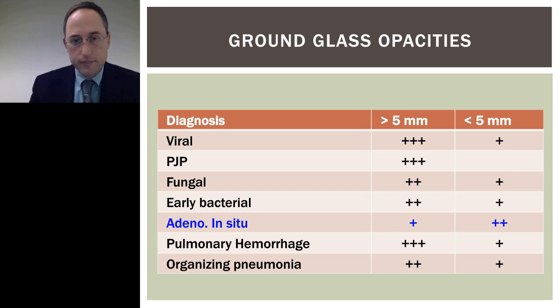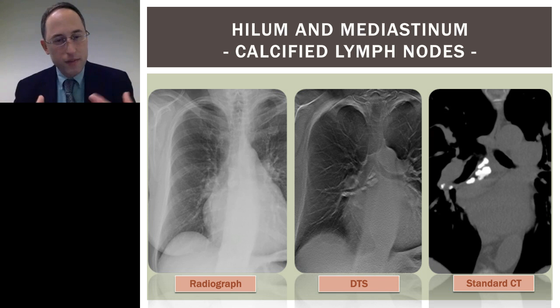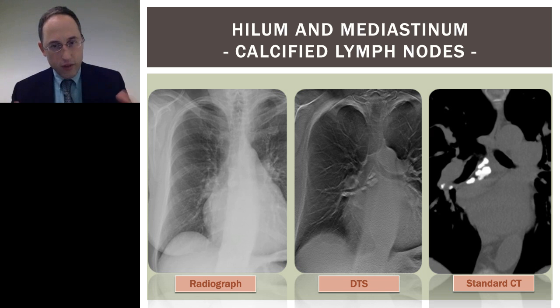Okay. All right. Let me show you just some other areas where tomosynthesis can have some findings in the hilum, which is the mediastinum and hilum, which is a tough place for radiography. You do get an improvement in contrast resolution with tomo compared to radiography.